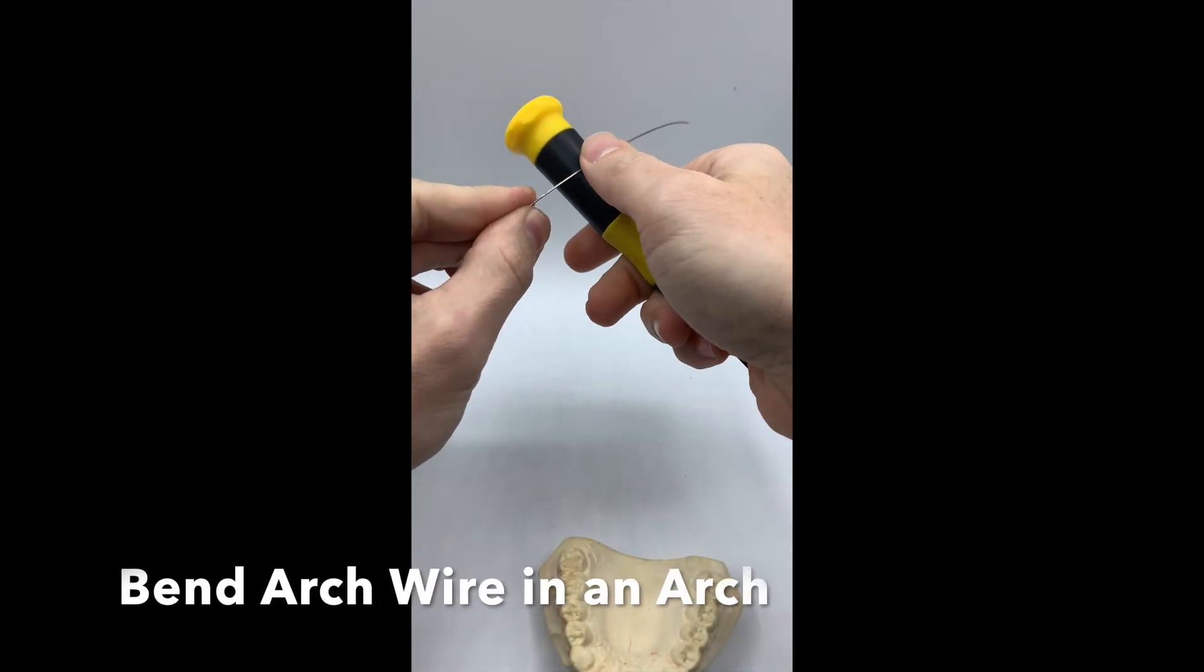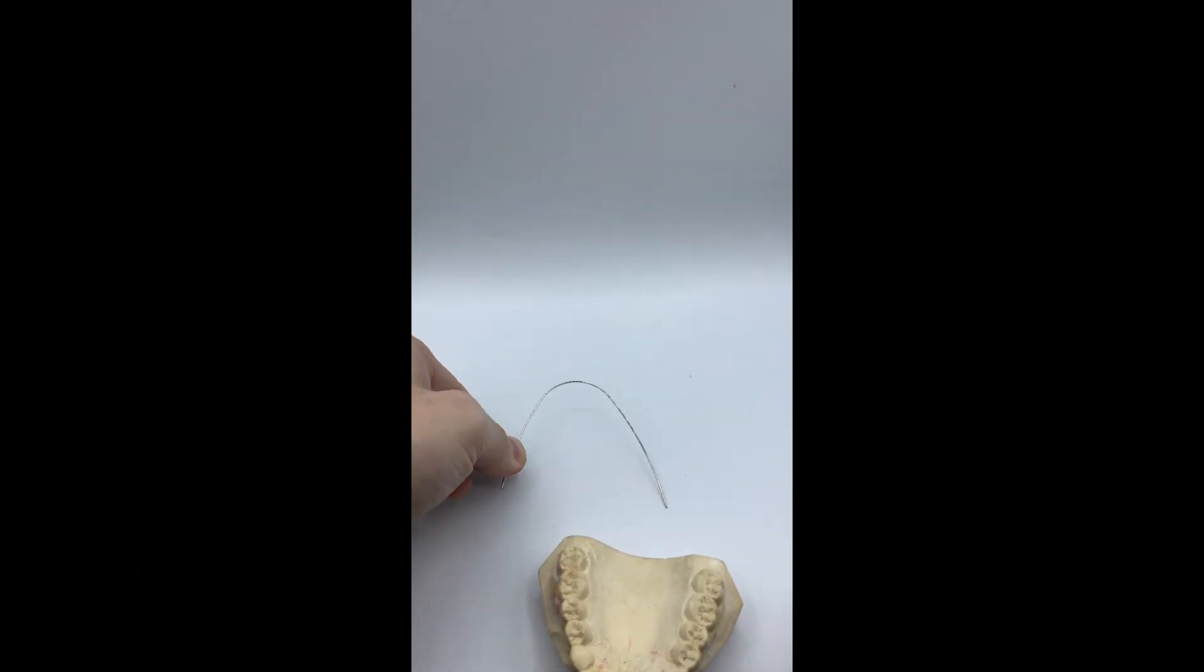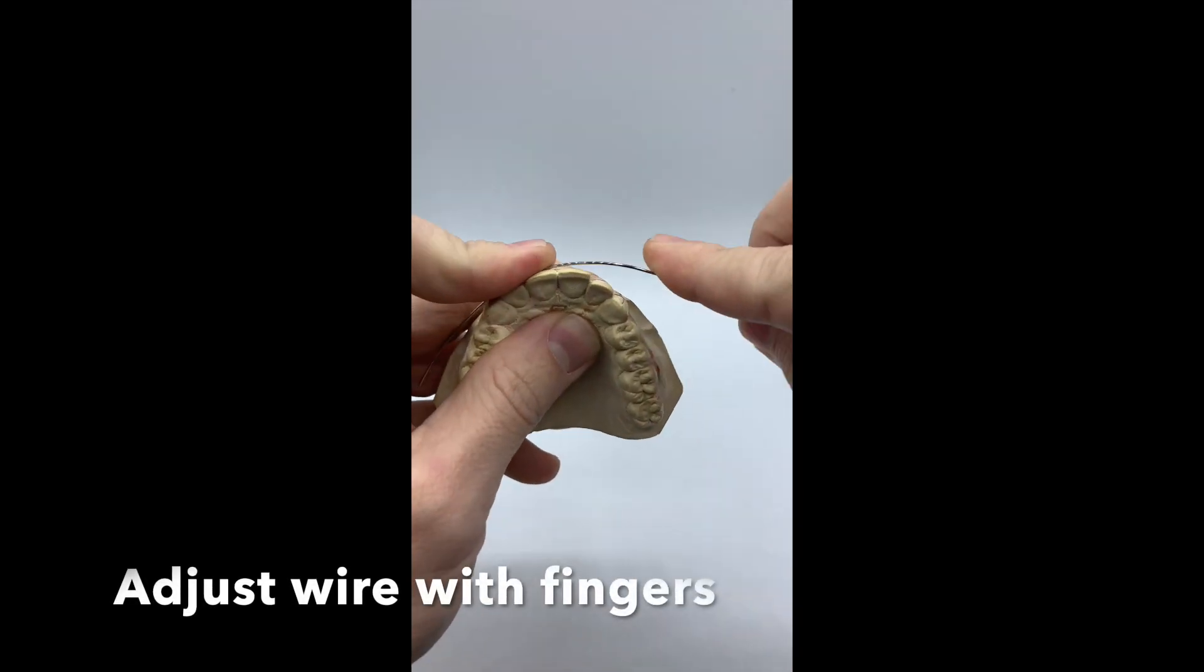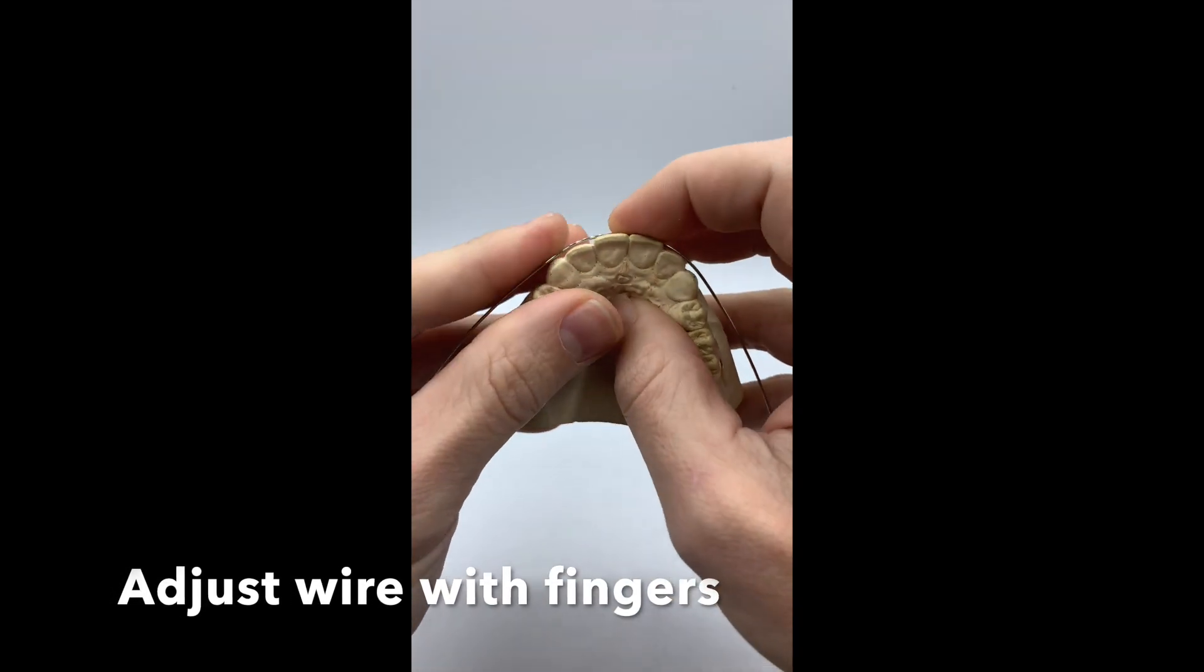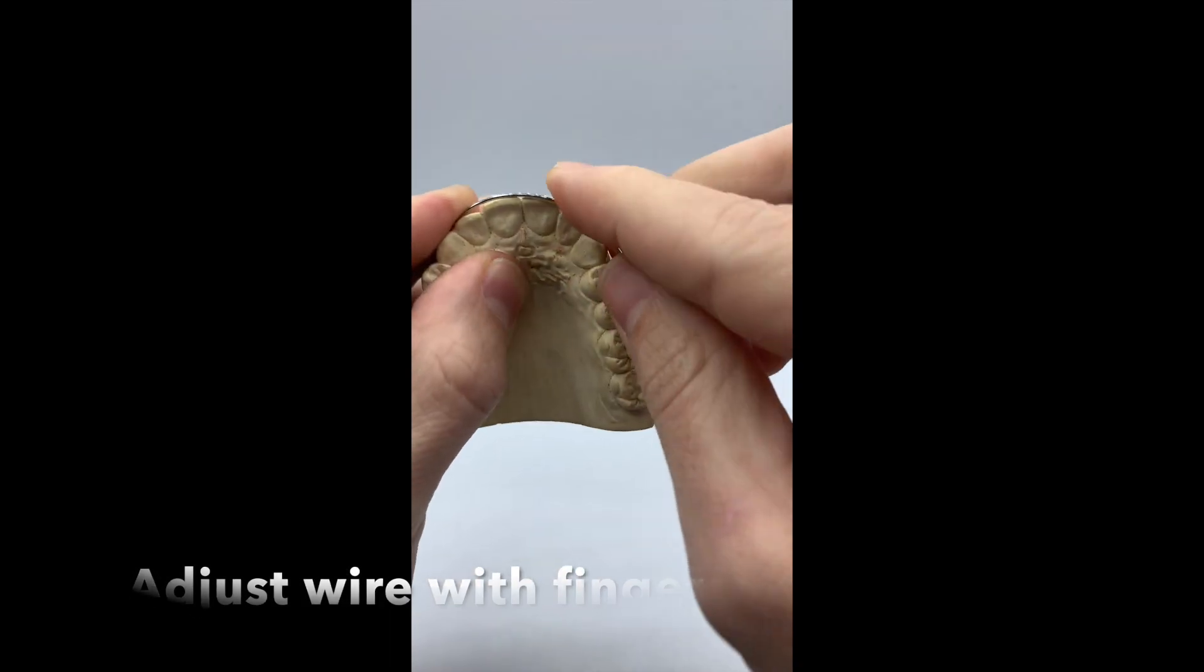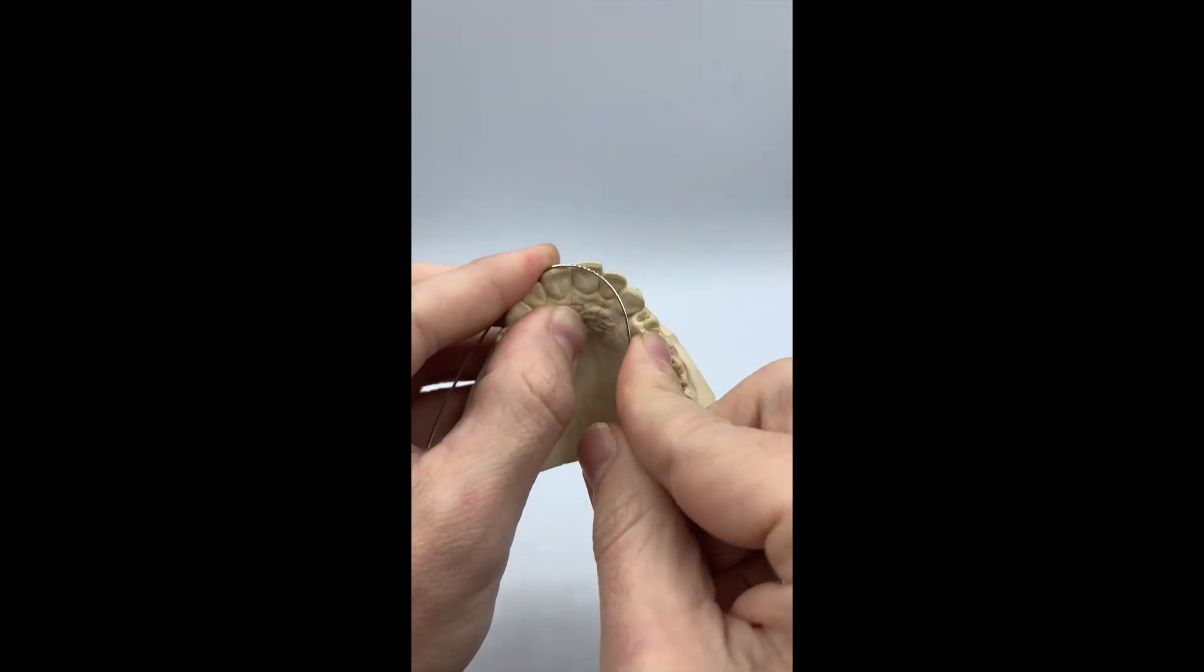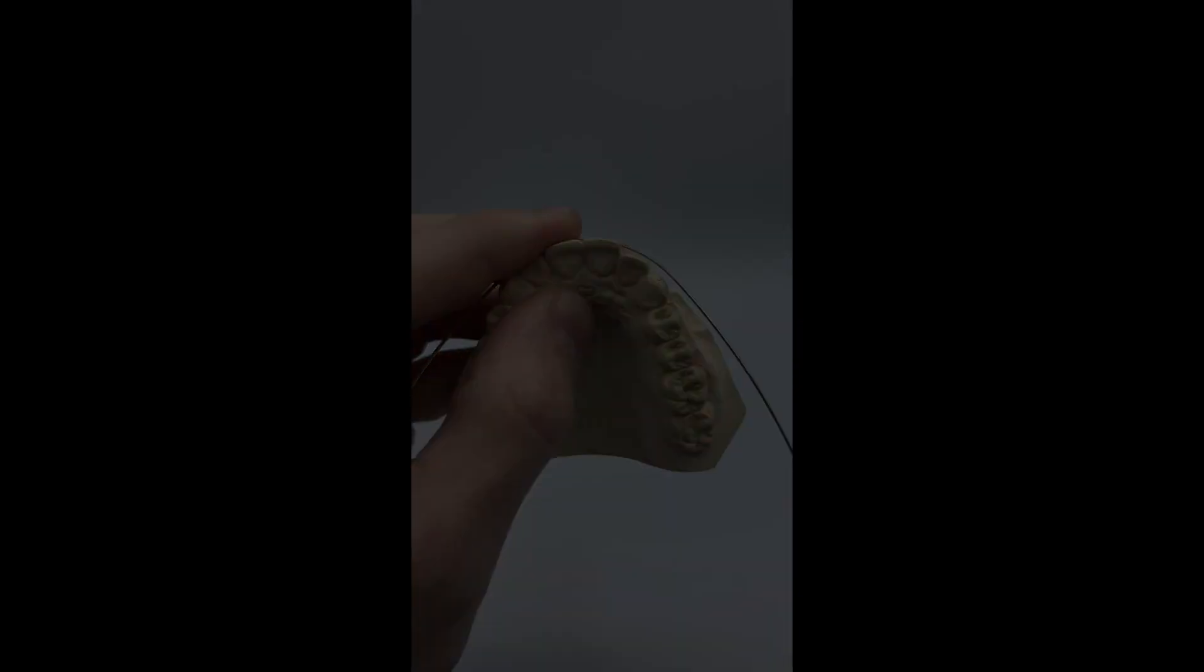You want to bend your arch wire in a symmetrical arch. With light adjustments with your fingers, you can apply pressure to allow the wire to touch all anterior teeth. If some teeth are in malocclusion, you will need your plier to allow it to touch the teeth.